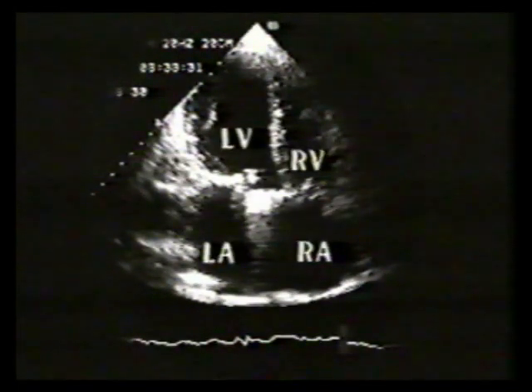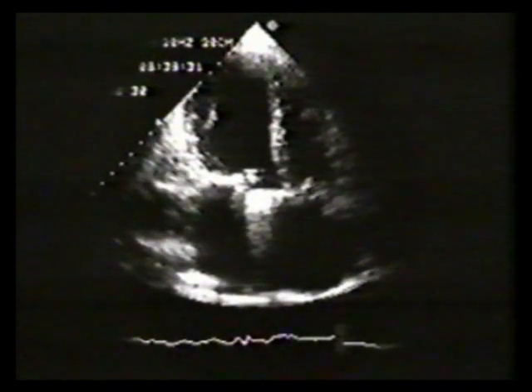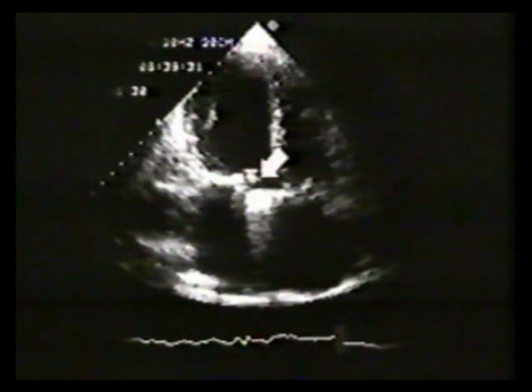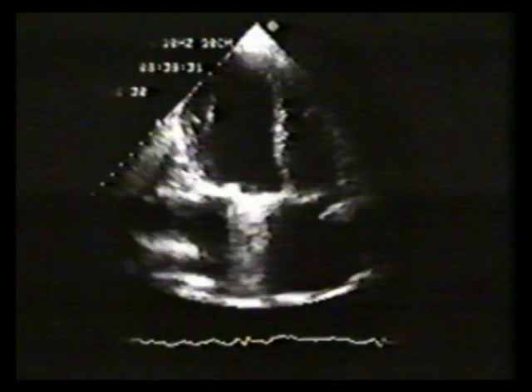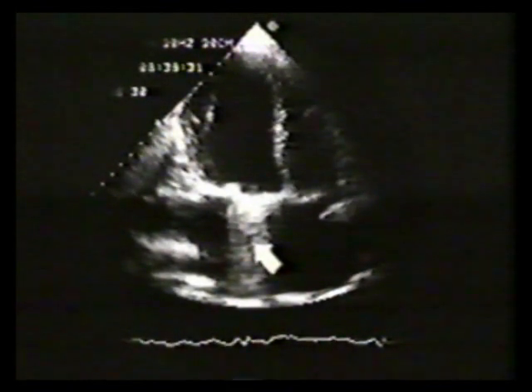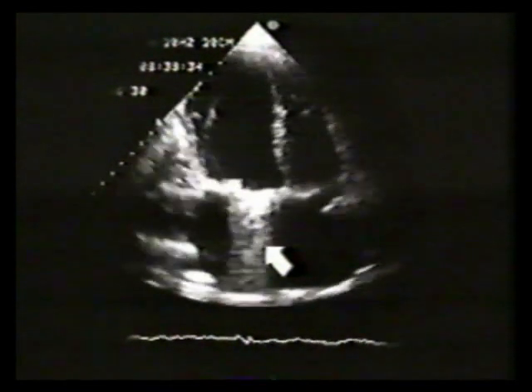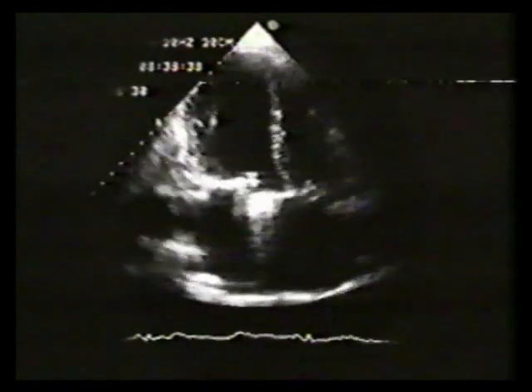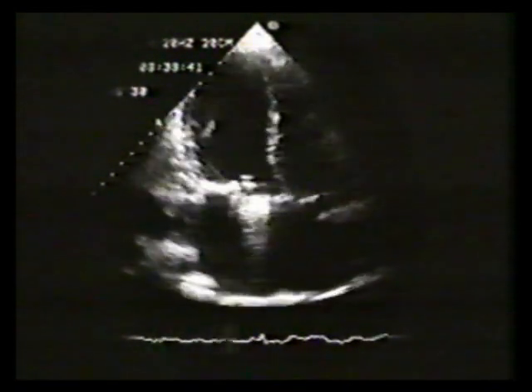This 42-year-old female has a Bjork-Shiley mitral prosthesis and a bioprosthesis in the tricuspid position. At this time, we will focus attention on the mitral prosthesis. This is the sewing ring, and this is the disc in the fully opened position. In systole, a characteristic rectangle of reverberations is seen in the left atrium behind the closed disc. Note that the patient's prosthesis is normally functioning, but LV function is severely reduced.